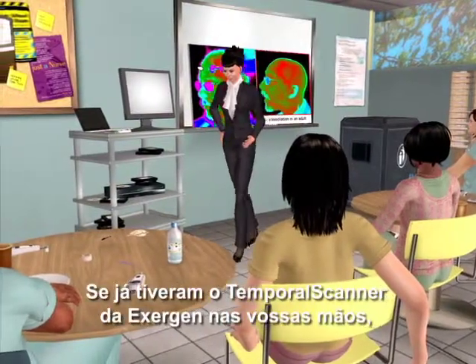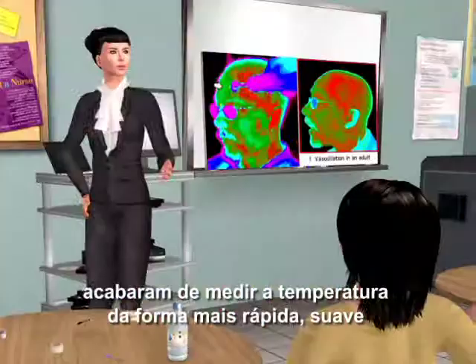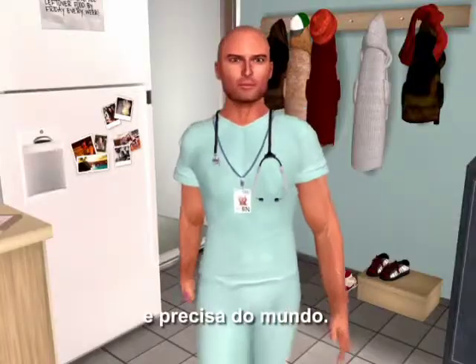If you had had the Exergen temporal scanner in your hand, you would have just taken the fastest, gentlest, most accurate temperature in the world.